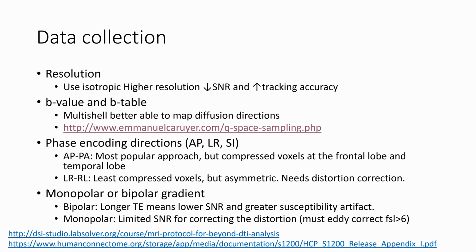So you can do right to left as well, but right to left will cause distortion, so that one side, the front, the brain is shifting over to one direction, the other side is shifting over to the other, and that can lead to finding asymmetries in your data, which is weird, but it can be corrected and you get less signal distortion. So while the anterior-posterior is the examples you see most, right-left isn't a bad consideration to do, and things like the HCP protocol are using right-to-left.